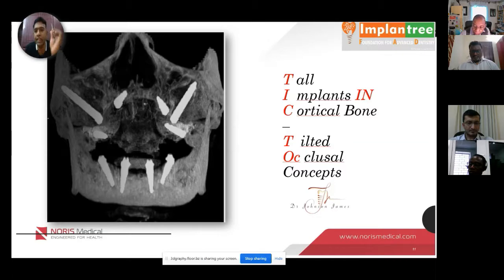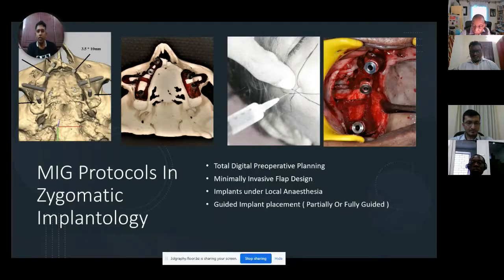So it's totally digital preoperative planning. The more time you work with John and his team and the radiologist, the less time I have to spend on the chair. So what happens is I can complete an all-on-10 on the upper, as I said, the same configuration. This is an all-on-10 configuration. Okay, so 4 implants lower, 6 on the upper.